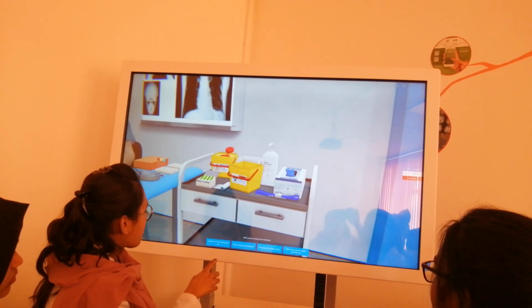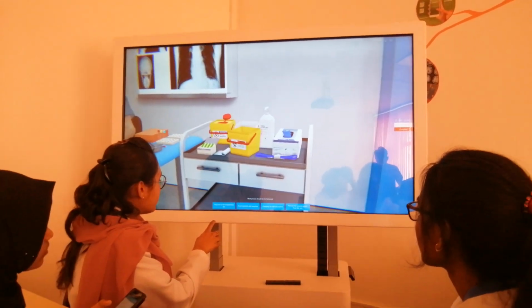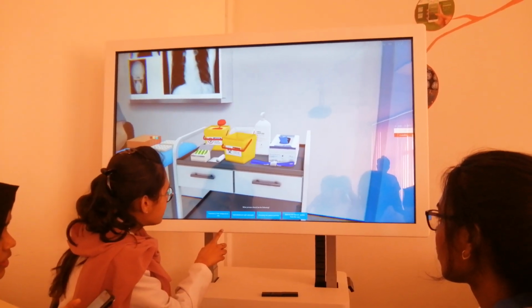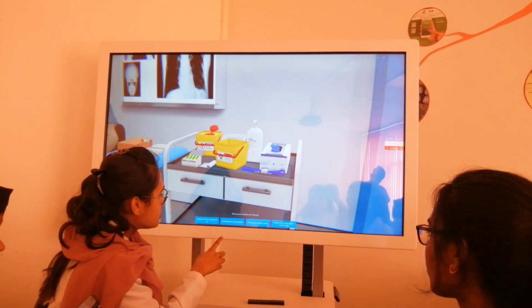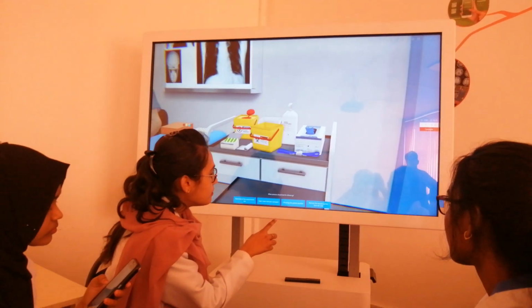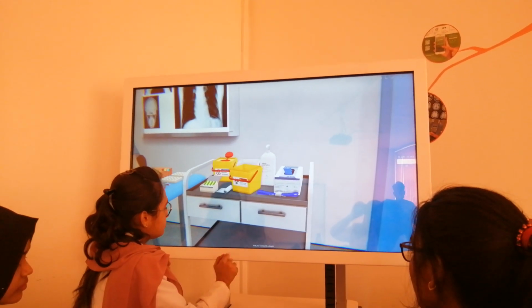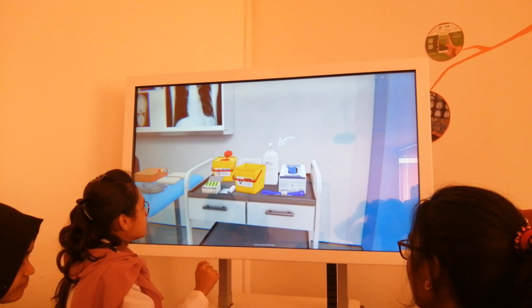What process should be the following? Treatment of the venipuncture site. Hand treatment with antiseptic. Choosing the patient position. Remove the vacuum system from the vein. Hand treatment with antiseptic. Treat your hands with antiseptic.